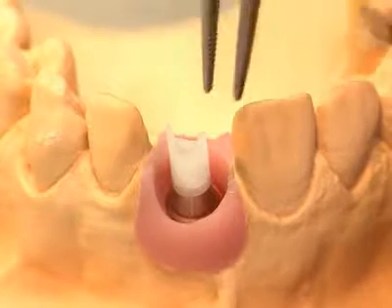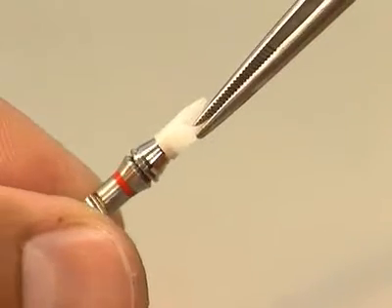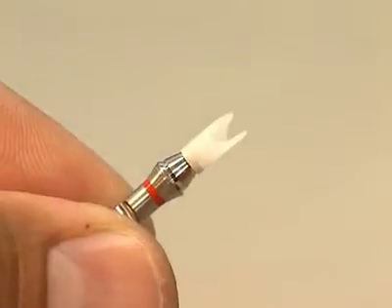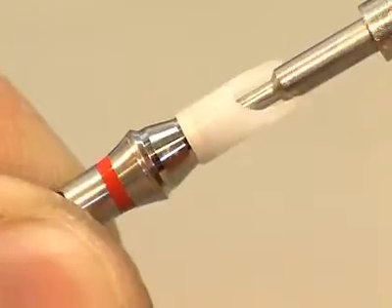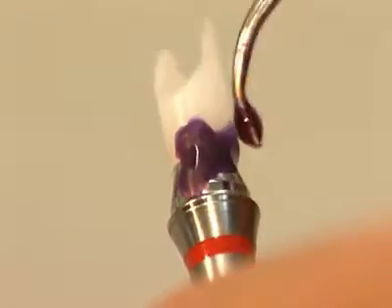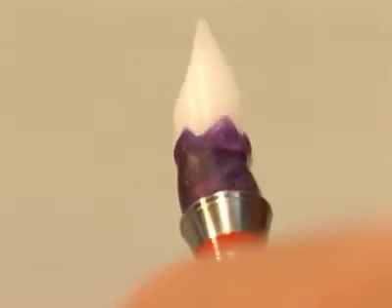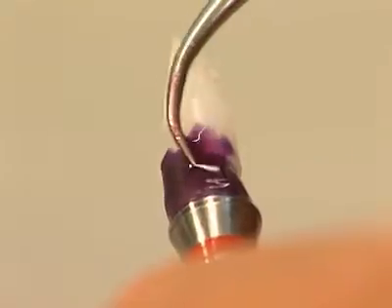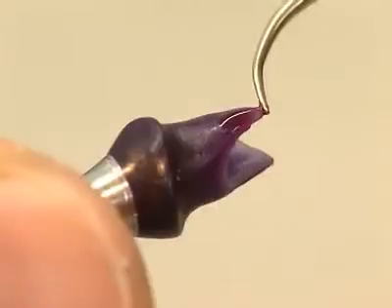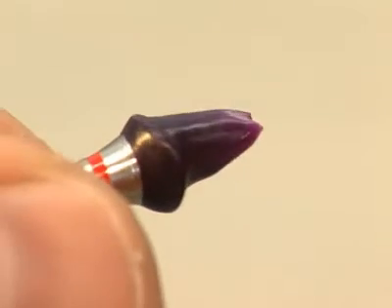Always do the cast with a modelling aid. Otherwise, the dental casting metal alloy will not, or only too thinly, flow out at the upper coping rim. A wax modulation is contoured according to the anatomical circumstances of the individual case. It's important that the wax modelling on the abutment has a sufficient thickness of at least 0.7 millimeters. Do not cover the delicate margin of the abutment with wax.